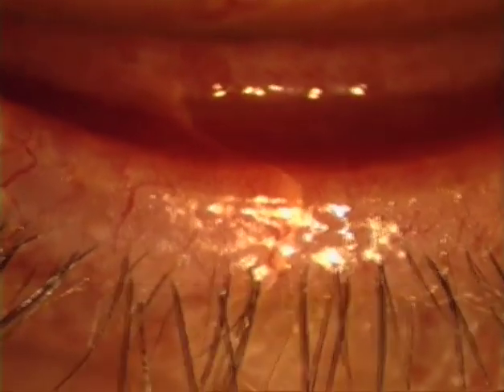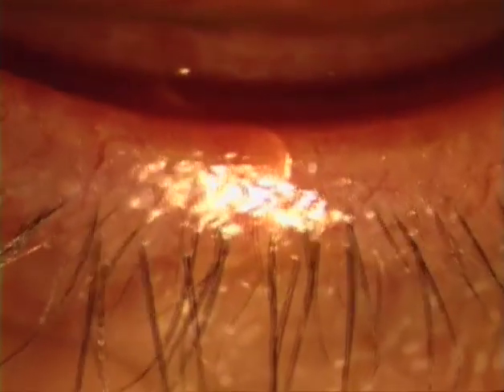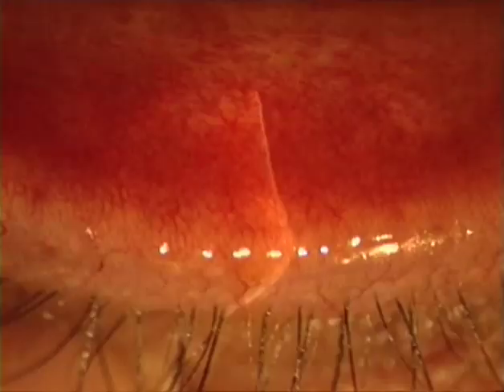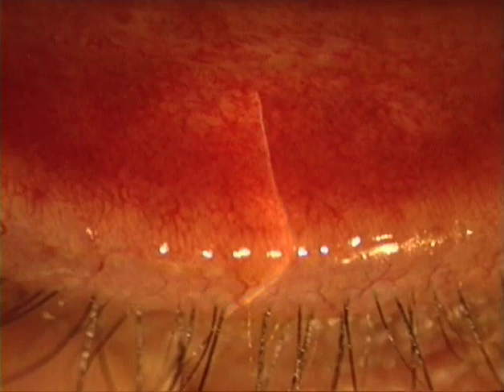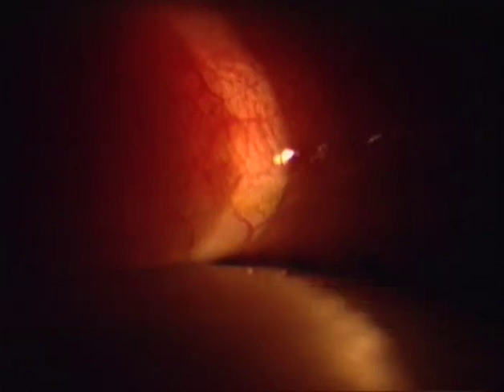If the insufficient apposition has been caused by a faulty position of the lid, as in this case of ectropion, the inner edge remains rectangular, as shown in the optical section with the narrow slit light. If, on the other hand, the faulty apposition has been caused by a change of contour of the inner edge, the narrow slit light reveals a round contour instead of a right-angled contour.